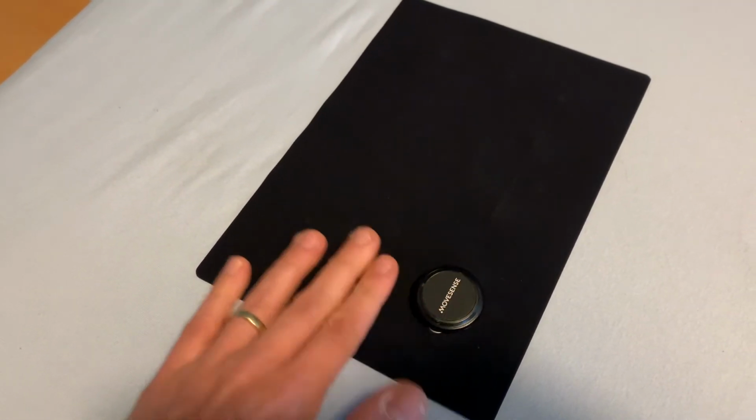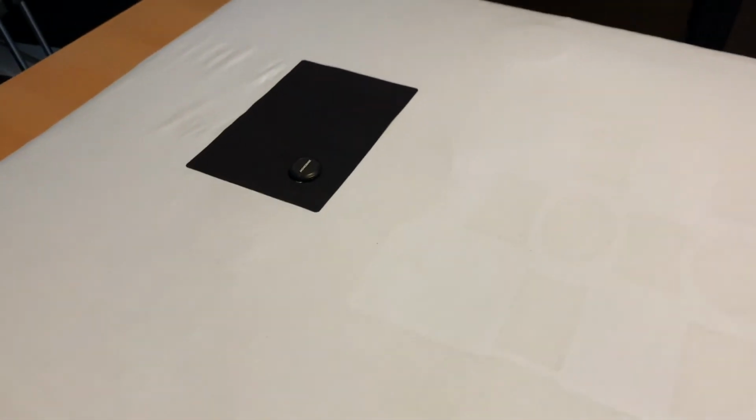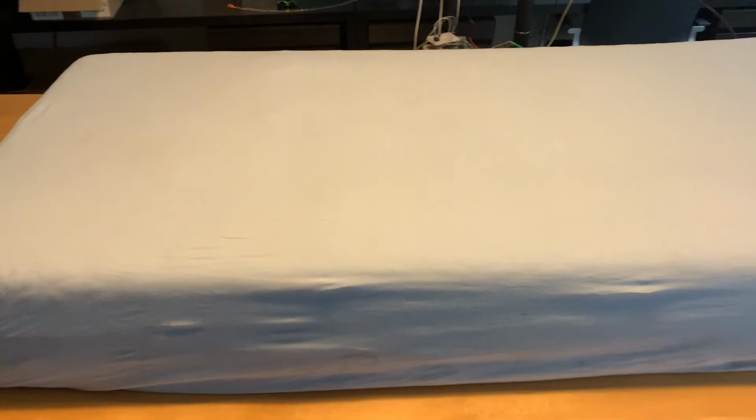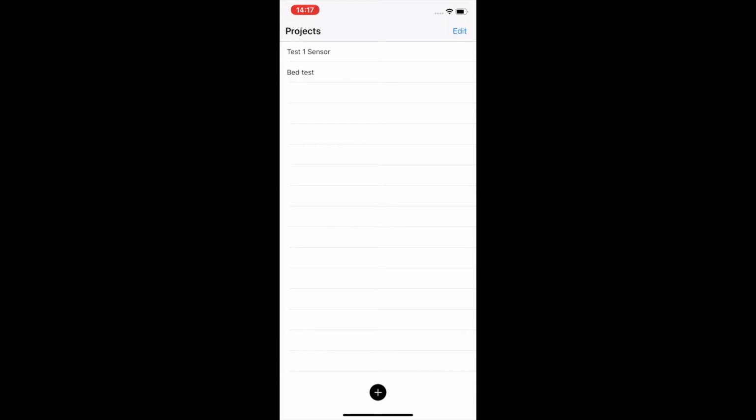If you have a sheet on top of it, just to demonstrate how you can actually use it. So we put it all under a sheet. Normally there would be a topper on top of it, so you can combine it in which layers or in which sandwich layer you really want to do it, but you can put a topper so that you don't really feel the bed sensor. So now we go directly into the Data Collector Sleep.